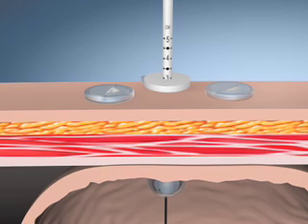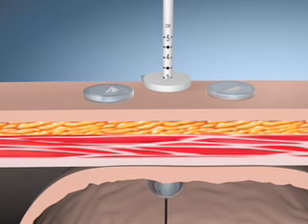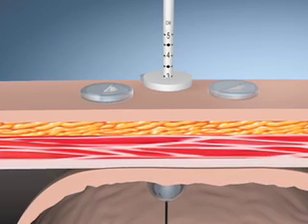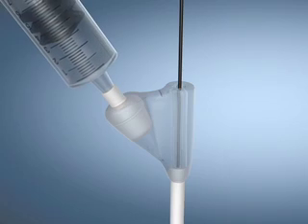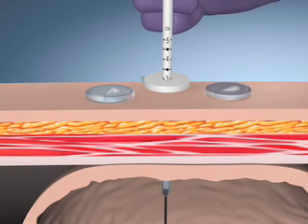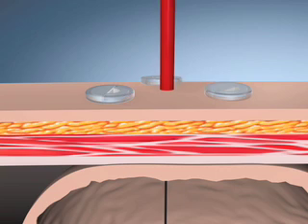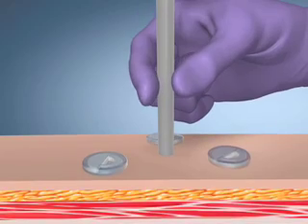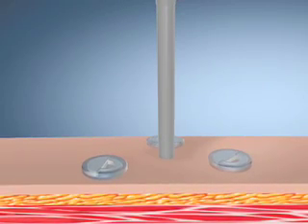Add an additional 4 to 5 millimeters to the measured shaft length to ensure a proper fit post-tube placement. Record the final measurement. Remove the water in the balloon and the stoma measuring device, leaving the guide wire in place. Resume dilation by advancing the dilator over the guide wire, through the stoma tract and into the stomach. Continue dilation until all dilator sleeves have been advanced.